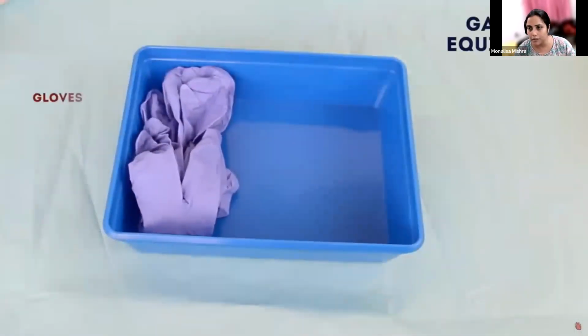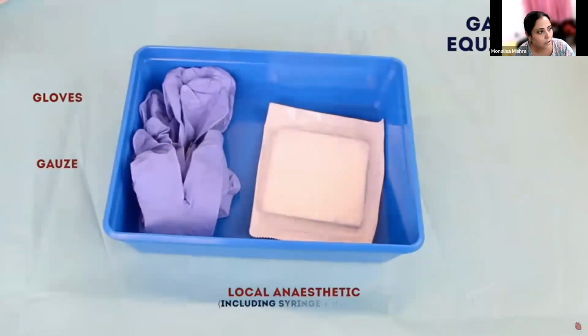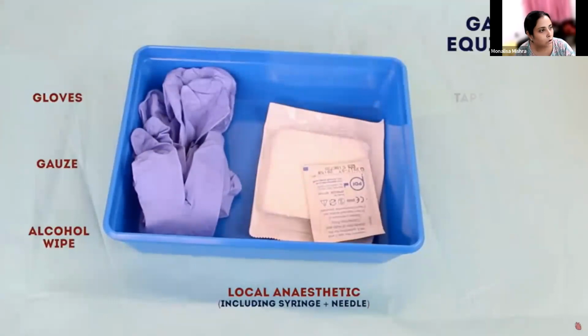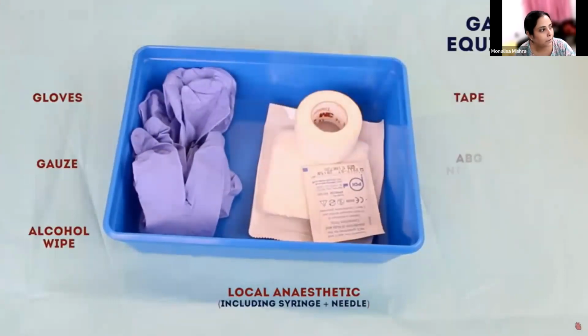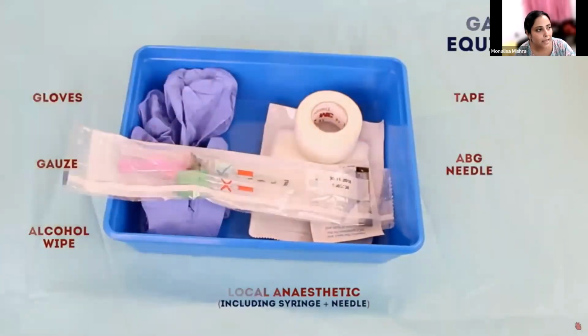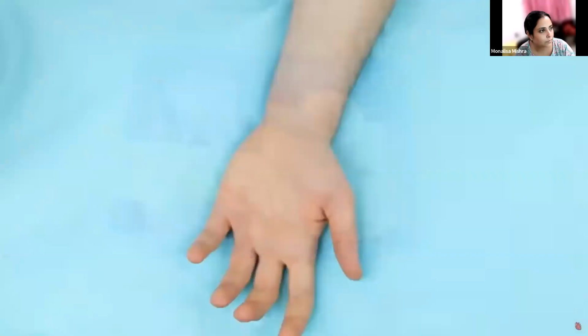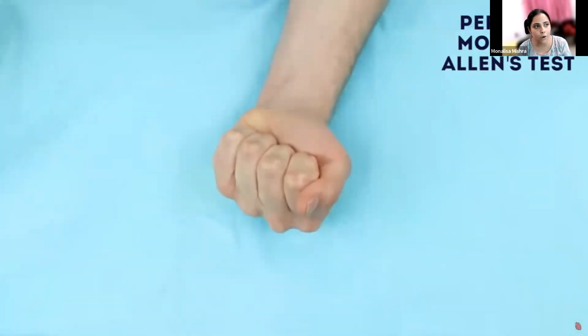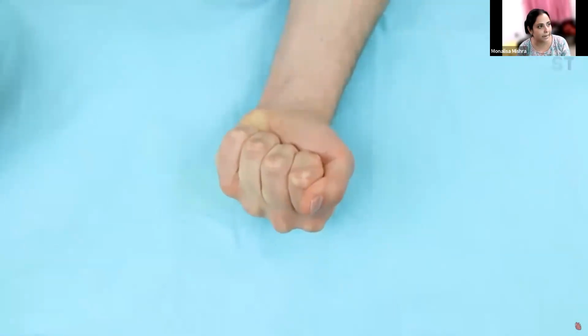Then you have to gather all the equipment: your gloves, gauze piece, local anesthetic, alcohol swab, tape, alcohol wipe, ABG needle. Then you have to perform the modified Allen's test, which we'll discuss. You ask the patient to clench their fist tightly.